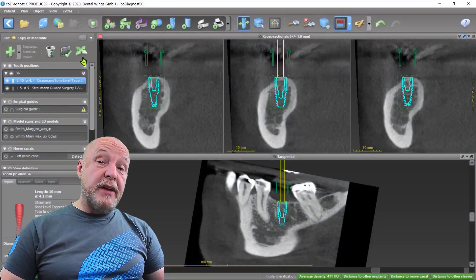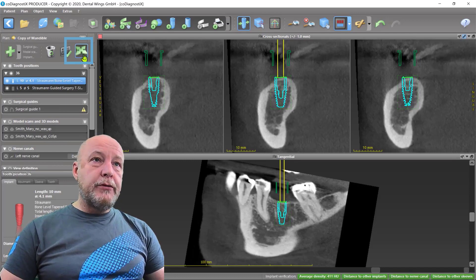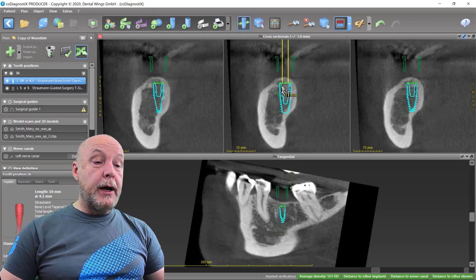Moving an implant seems to be one of the basic functions, but you can do a little bit more. You have to activate the implant with the cross, and then by pressing the left mouse button you can move the implant left, right, up, down.